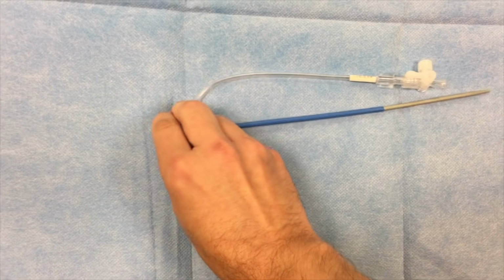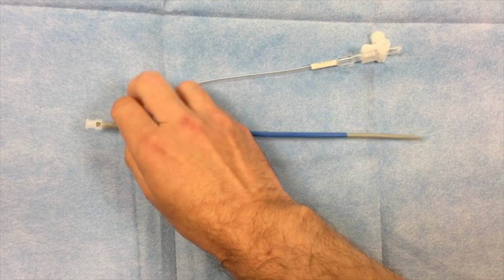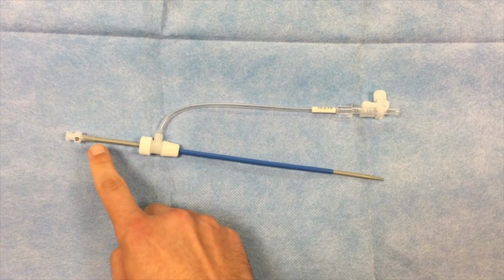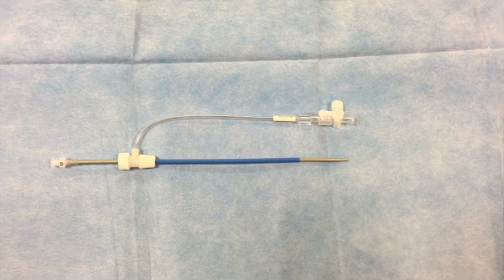And then once this is in, you would essentially remove this dilator and then you can hook it up to a saline flush, and then you can enter other catheters and wires through here for your intervention.